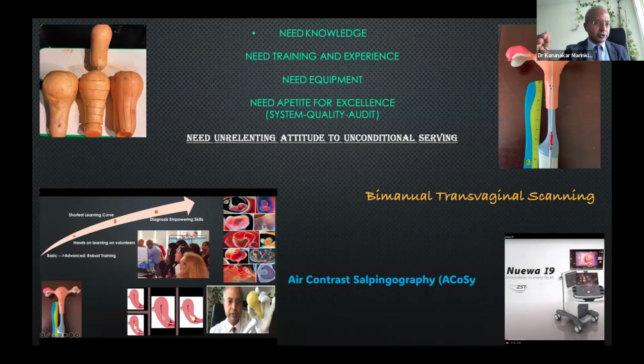MRI has its big advantage, and then your senior opinion is another input. So there is no saying that dogmatically buying an expensive ultrasound machine and having your FRCR makes the diagnosis accurate, because pathologies don't allow ultrasound to reveal themselves to a large extent.